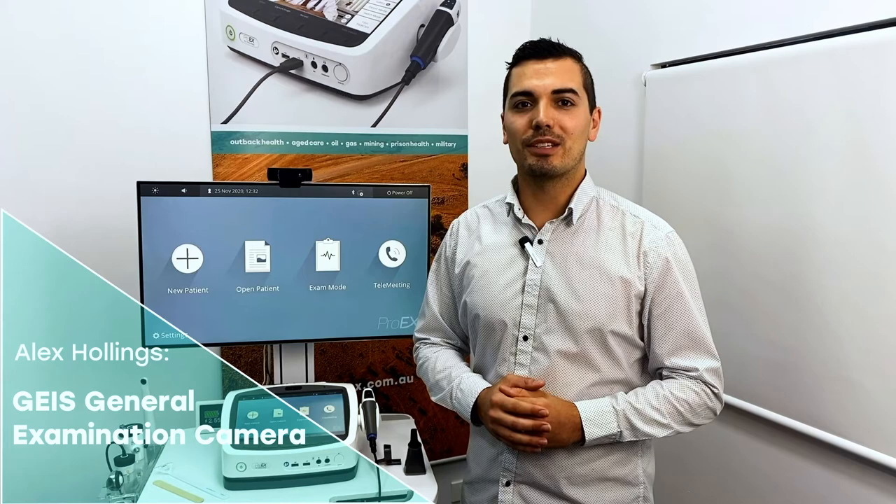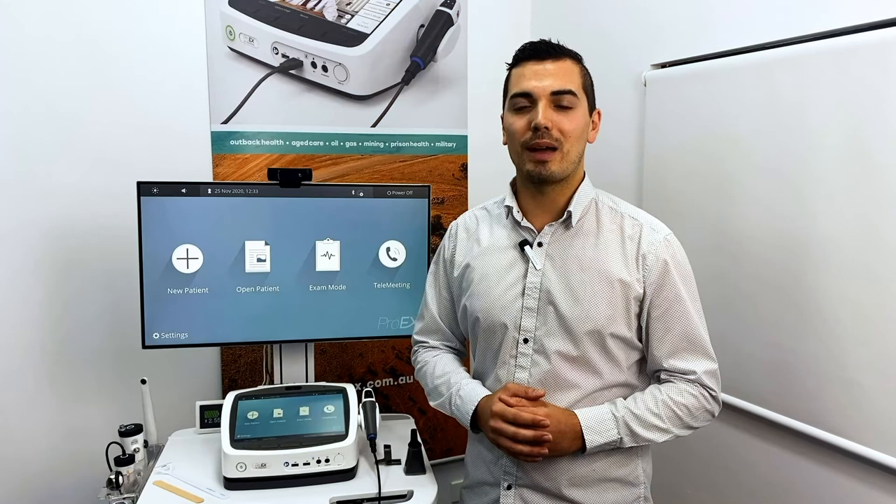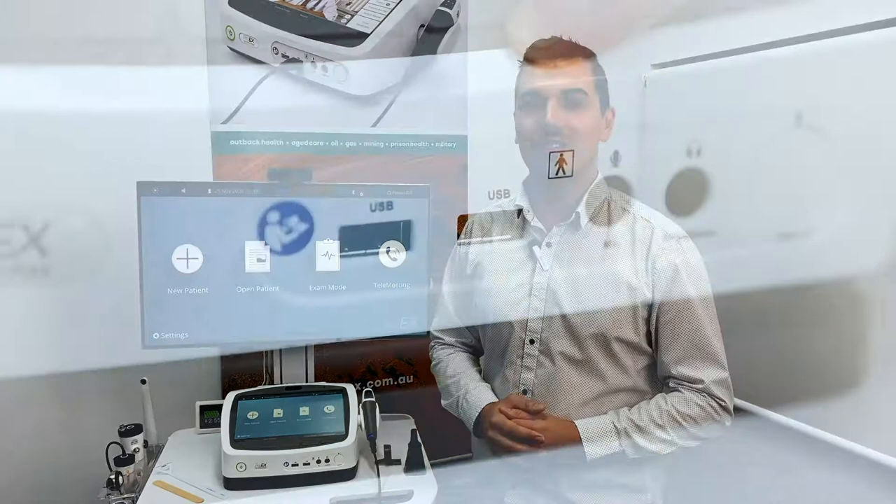Hi, I'm Alex. Today I'm going to talk to you about the GEIS General Examination camera. The GEIS camera is a full high-definition medical camera that connects to your ProEX via USB. It can also be used with a PC or a Mac. To connect your GEIS camera with your ProEX, insert the cable into the USB port here.